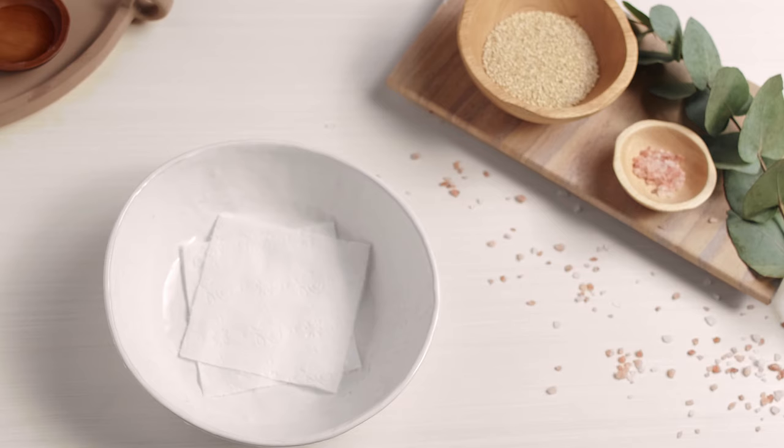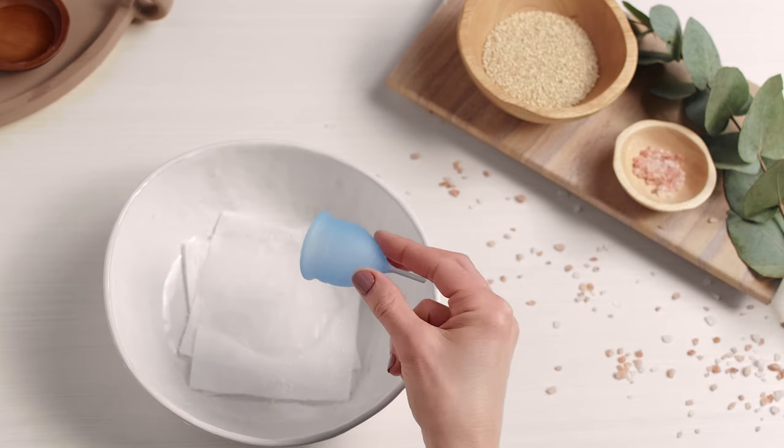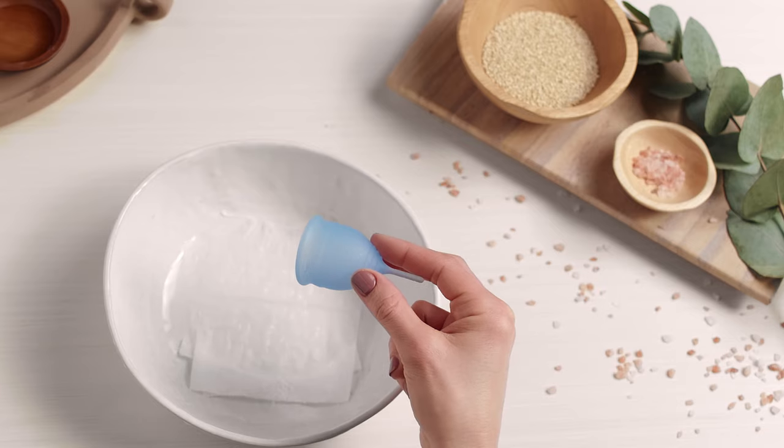Just another tip: since blood is denser than water, it can leave a mark in the toilet bowl. So lay a couple sheets of toilet paper in the bowl before emptying your cup.